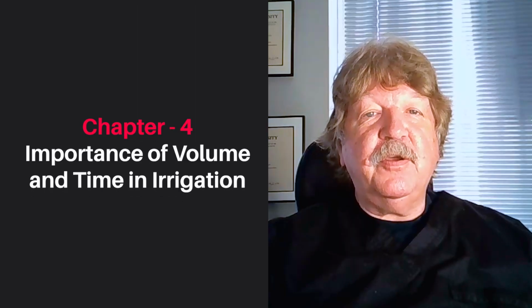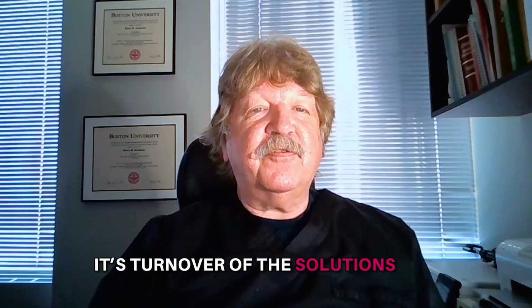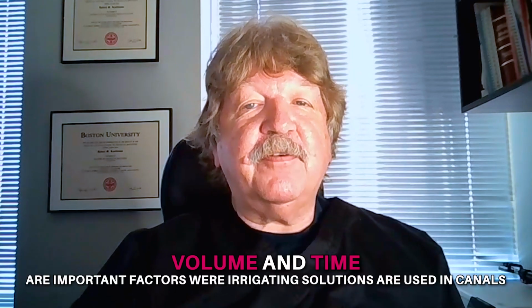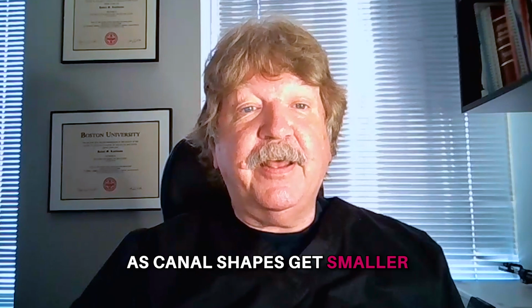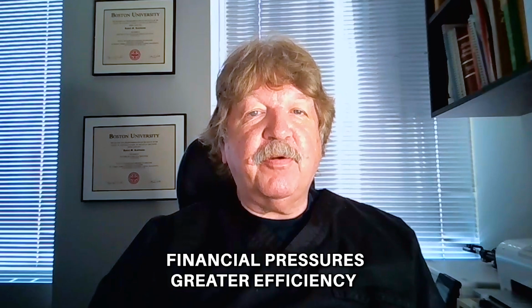Part of the problem with endo irrigation is the limited volume of the canals themselves. Studies generally agree that it's turnover of the solutions and copious irrigation that seems to work best. So volume and time are important factors when irrigating solutions are used in canals. As the canal shapes get smaller, this becomes even more challenging. With financial pressures and greater efficiency of rotary instruments, there is a tendency to want to do these cases fast.